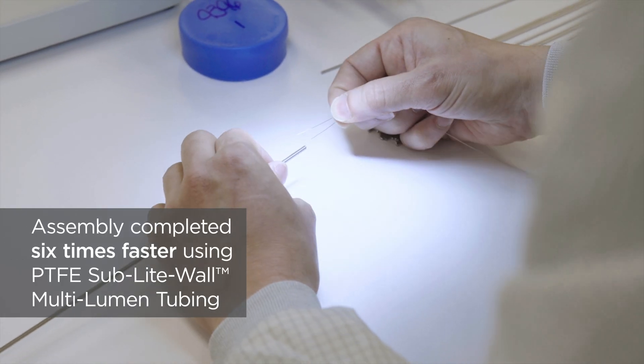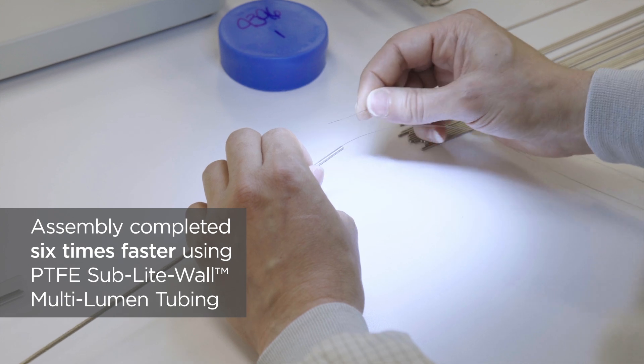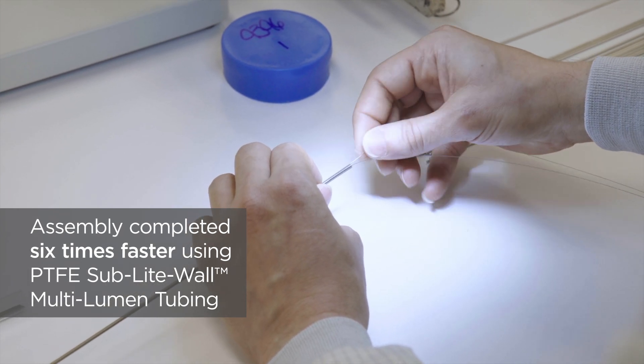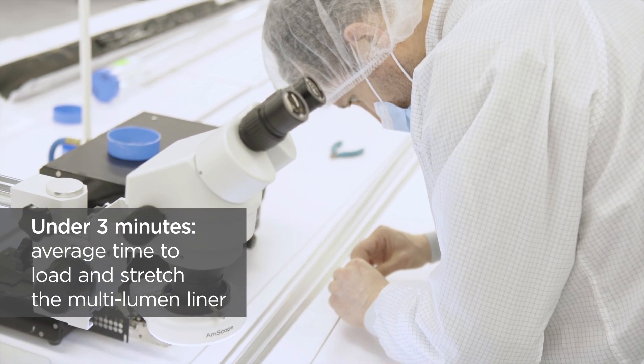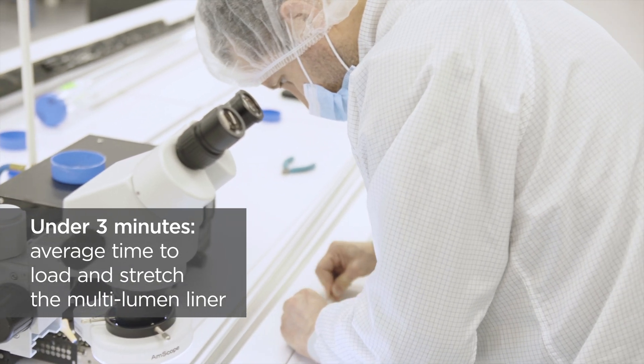In comparison, operators building the 20 steerable catheter shafts with PTFE sublite wall multi-lumen tubing were able to complete the assembly six times faster than using the traditional method. With no need for glue, on average they were able to load and stretch the multi-lumen liner in under three minutes.